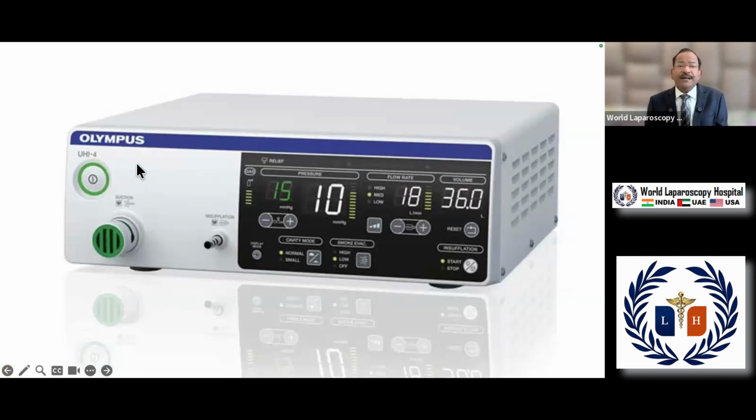This is the quadromanometric indicator. In every insufflator this is there. You can see here this is called preset pressure. Preset pressure you can generally increase or decrease. Generally we keep 12 to 15 in operative surgery. This is called actual pressure. This is called flow rate. Flow rate initially you will keep at 1 liter per minute, but once the port is introduced then you can increase. And here this is called total amount of gas used, that is called volume.